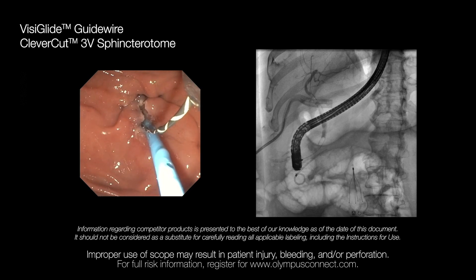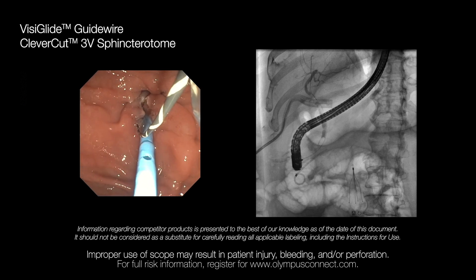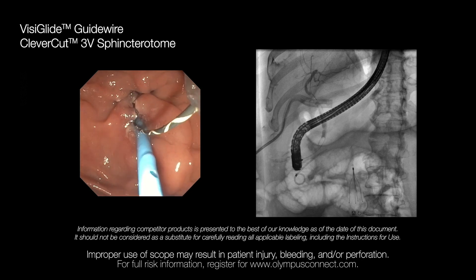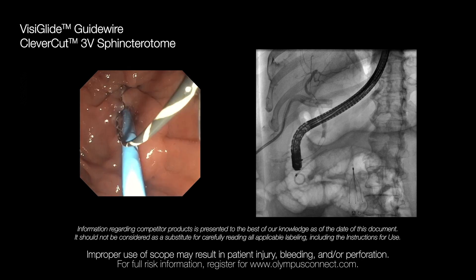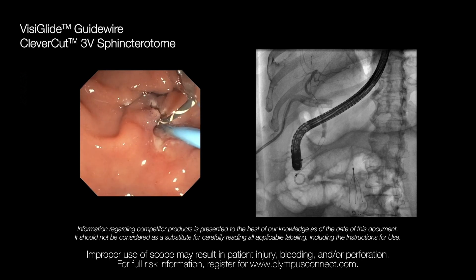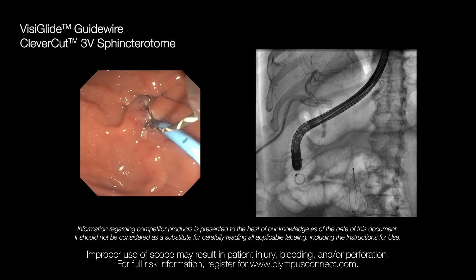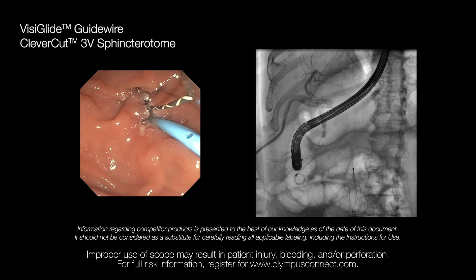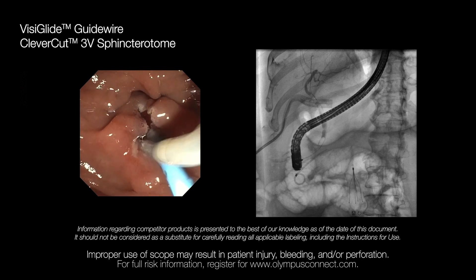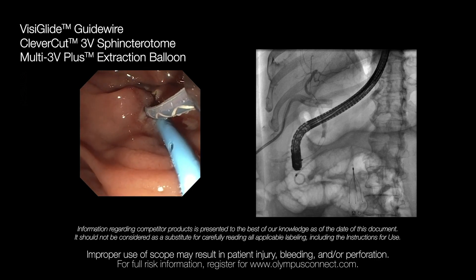Here you can see the wire is properly initially locked. When I release the elevator, the wire moves to the left side of the elevator. In this case, if you maneuver the wire, it would not be properly locked and it will move in and out. What I do to overcome this challenge is simply release the elevator, which brings the wire back into the center of the elevator for me to lock it again. I am demonstrating that a few times. Once the wire is stable and locked, you can pass the accessories over it.